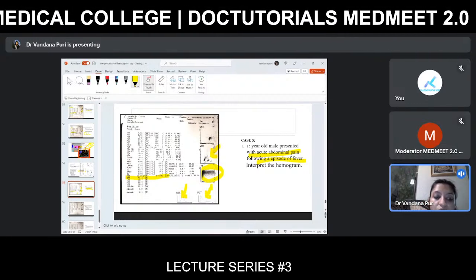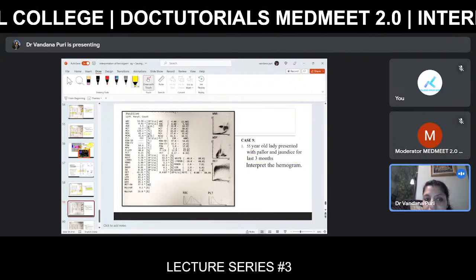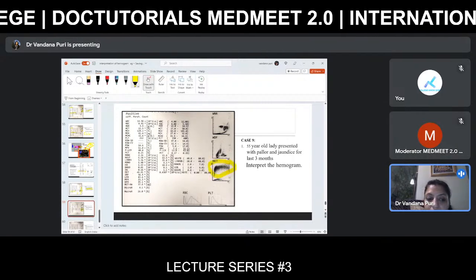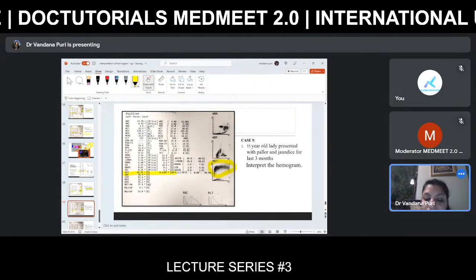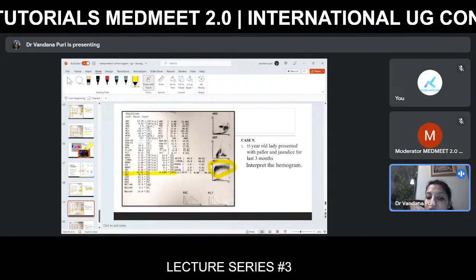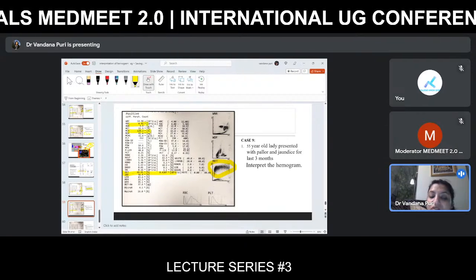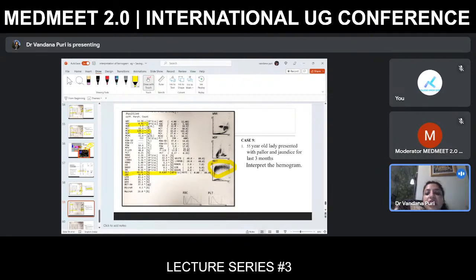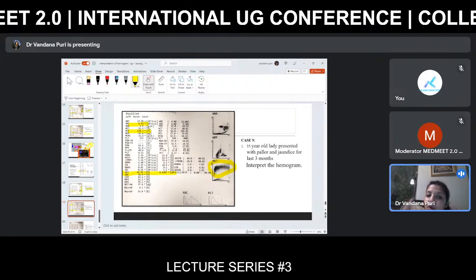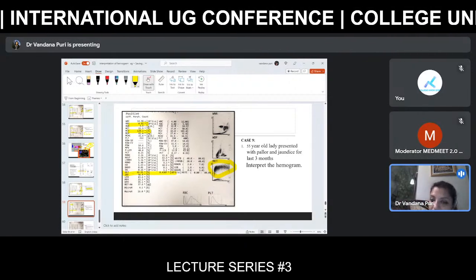So how to come to which type of hemolytic anemia? Obviously, smears help. But look at this case again. So same thing here, there are a lot of reticulocytes coming here. So the patient has reticulocytosis, but what catches your eye immediately, it should catch your eye, what is it? Your MCV is very high and your RBC count is very low. That means probably there are agglutinates, and this agglutinate is counted by your counter as one cell. So it is counting as very low RBC count with a very high MCV.